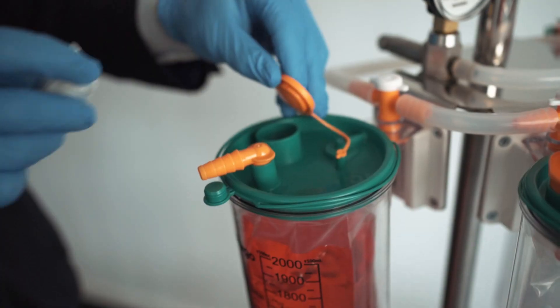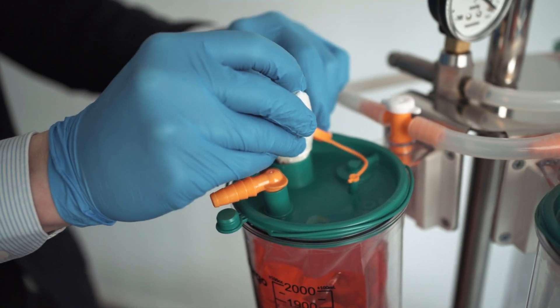Hallmark Surgical's recently launched suction liner system is now available with solidifying gel. This is brilliant for safe transportation of full liners. Either available as pre-filled liners or individual sachets which can be inserted through the sample port on the top of liners when needed.